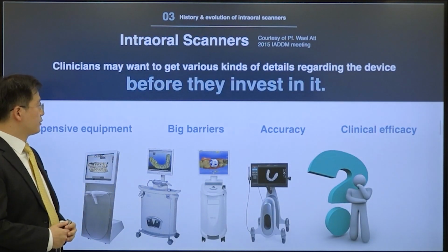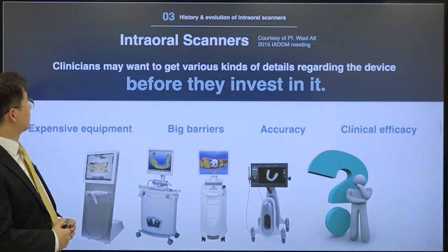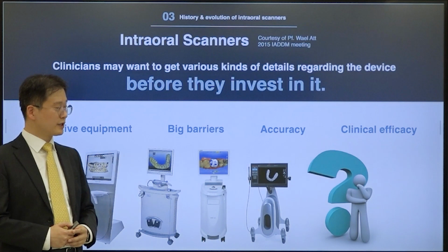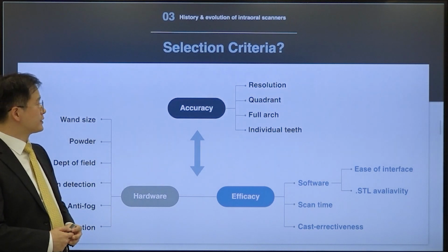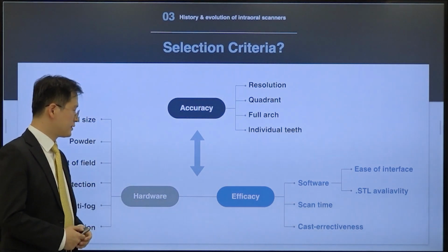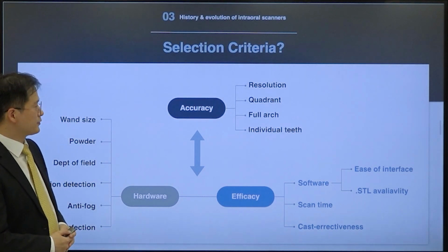Because the price of the device is very expensive, we have to get various kinds of details regarding this device before we can invest in it. So I can show you all the considerations about intraoral scanners. That will be accuracy, clinical efficacy, and hardware itself. With this lesson, you can understand all the details of intraoral scanners.